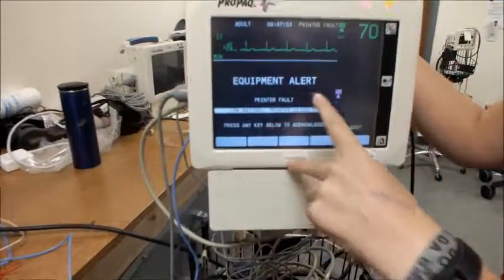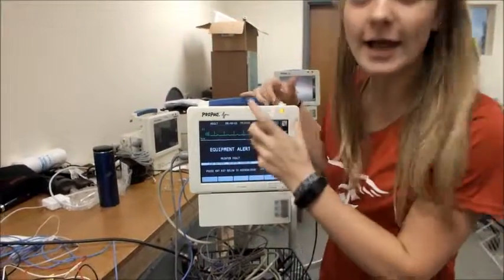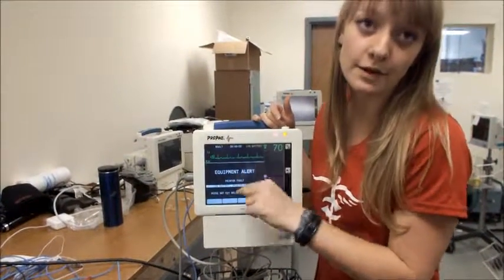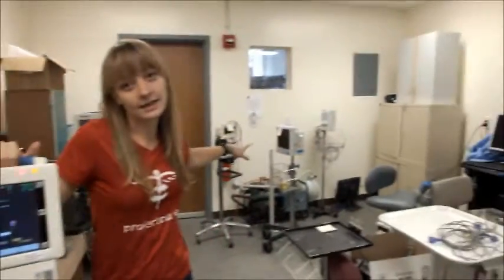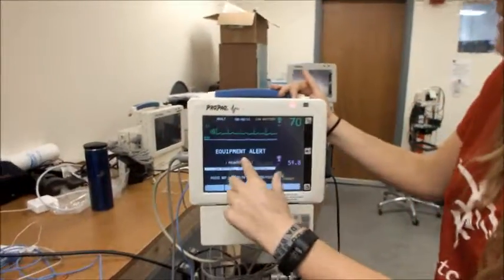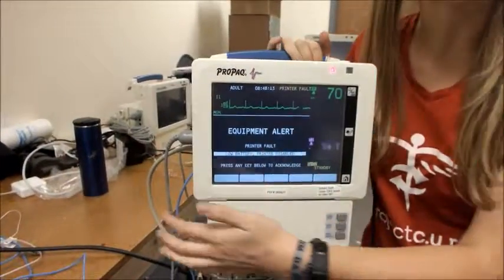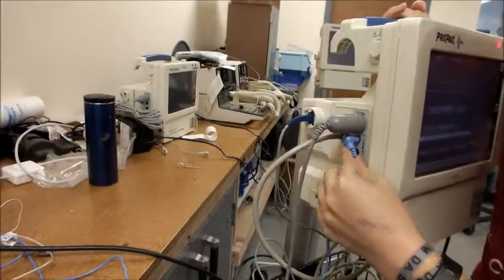Sometimes you might get an error such as low battery or equipment alert. If that's the case, write a sticky note saying the problem on the front of the screen and put it back in this area to have the battery charged. If you have an error that says the probe is detached, check your connections and ensure that all of your probes are working.